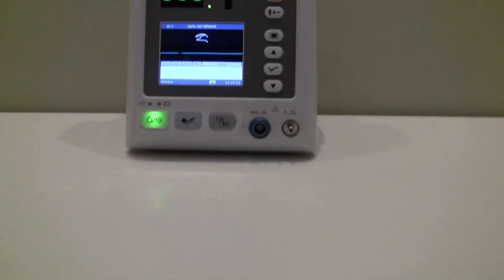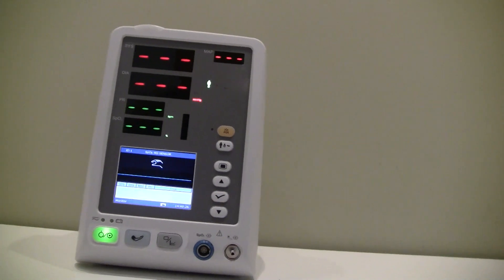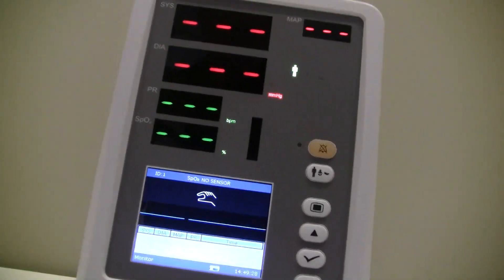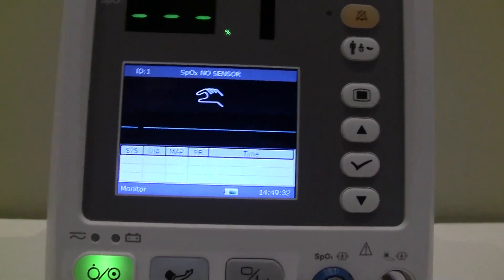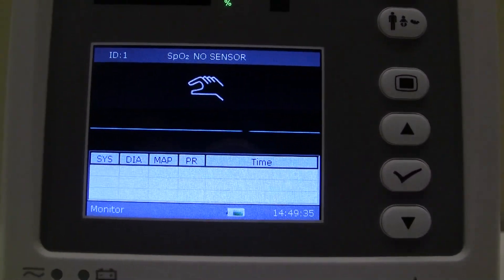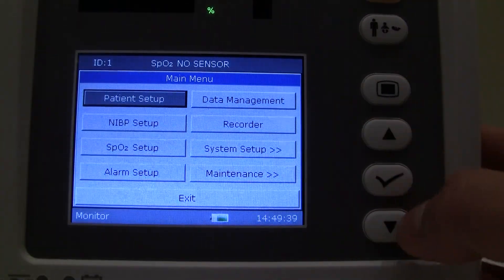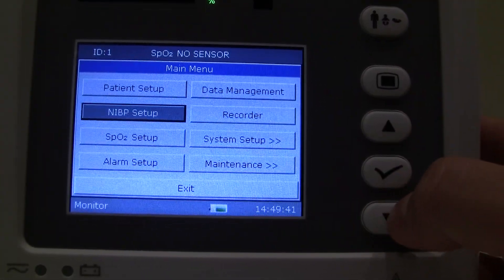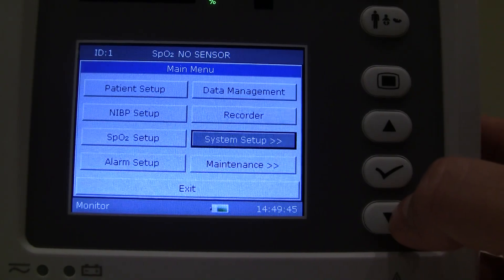As far as the interface goes, the unit is fairly easy to use. I'll zoom in on the display screen and take you through a couple of different options. Here's your main menu button.